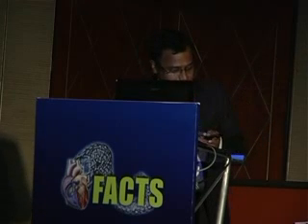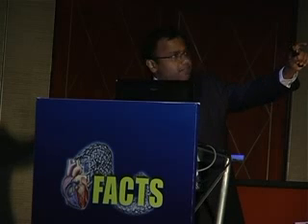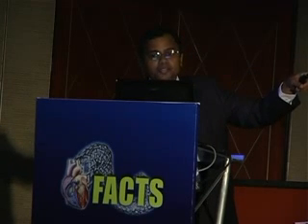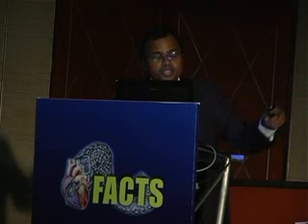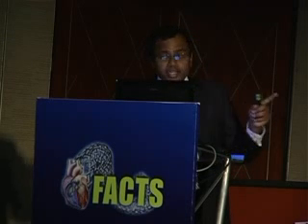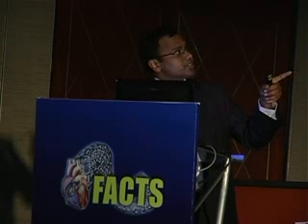This is the fifth intercostal space. You can see where the pacing device incision has been. This is about three days after they had tried putting a transvenous wire into the LV. We waited three days because of the contrast load. The creatinine on the day of surgery in the morning was 0.8 and then we proceeded with surgery.